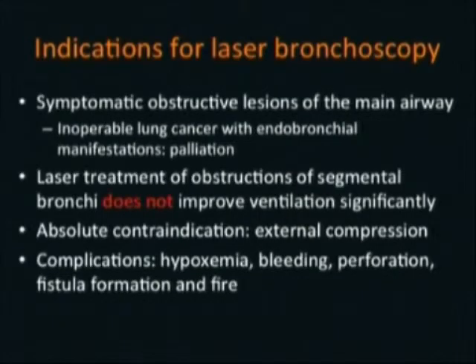I'm just showing you this to show you the study by Cavalier in the beginning of the 80s that published the biggest series of Nd:YAG laser with more than 1,000 patients and having really very low death rate, 5 treatment-related deaths. So they are safe therapy.